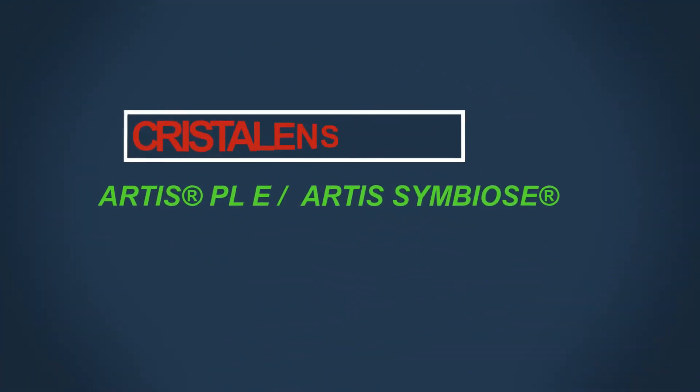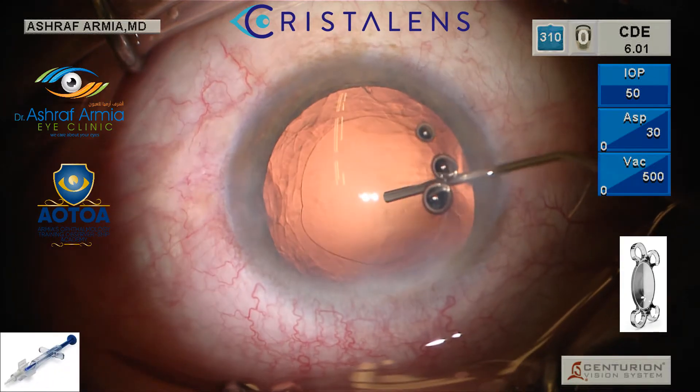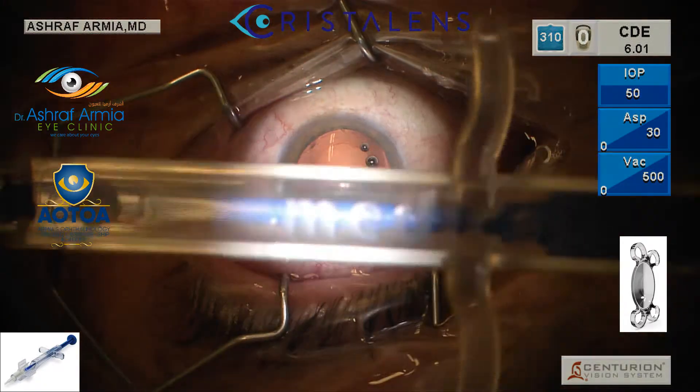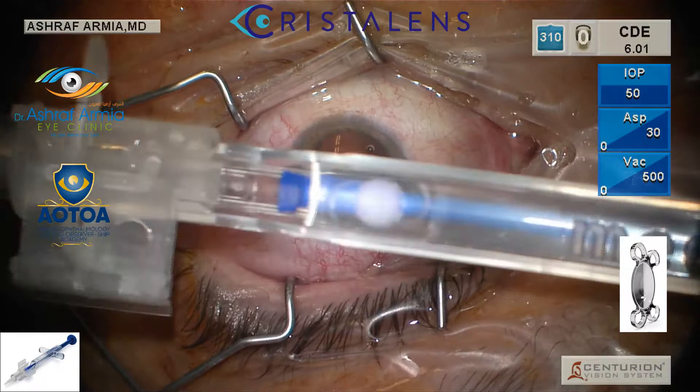In this video, I'm going to highlight some teaching points on how to inject the pre-loaded IOLs from Cristalens. First, you inflate your bag after you finish your phaco as usual. This is how it comes with the injector.